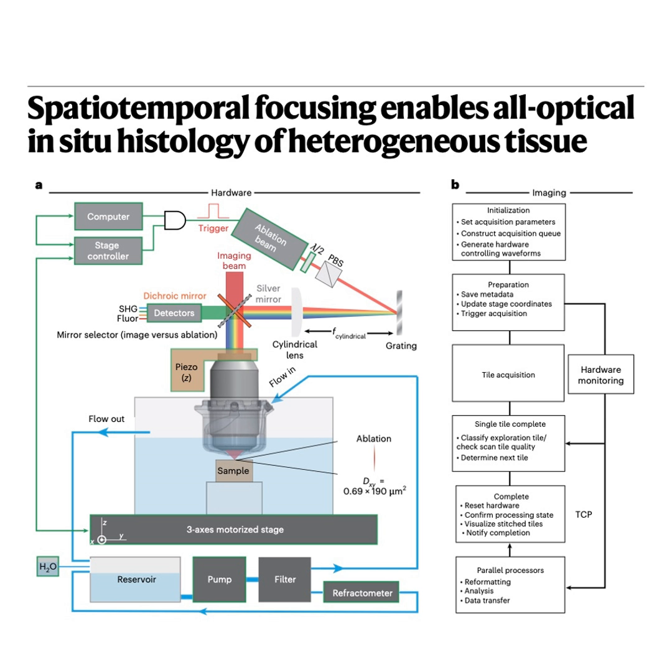Our sources describe a really significant breakthrough, a smart robotic system. Yeah, one that basically throws out the mechanical scalpel altogether. And uses light instead to do high-resolution histology in situ, right there in its original place. Exactly. And the core of this breakthrough is a laser technique called spatiotemporal focusing, or STF. It's described as maybe the ultimate shortcut, because it manages to preserve that crucial anatomical structure, especially at those difficult interfaces between different tissue types. And it delivers this detailed volumetric data on a scale that just wasn't possible before.